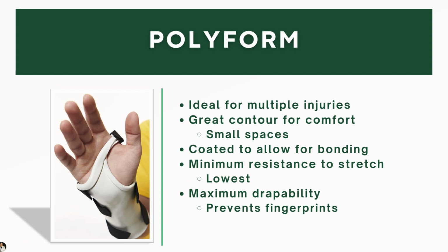It has minimum resistance to stretch, so it has the lowest resistance to stretch, which isn't necessarily a bad thing, and the maximum amount of drapeability. So this is going to prevent any unwanted fingerprints, anything that's going to be noticeable on the material. This also has great rigidity and strength once the material is cold and hard.